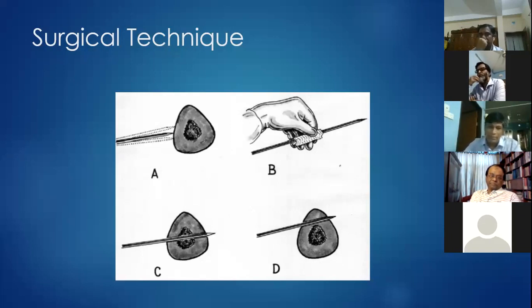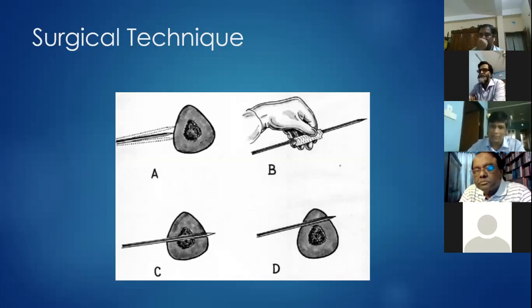When we reach the cortical bone, then start drilling with low speed drilling, and to avoid bending and to maintain a straight trajectory and to decrease the temperature or heat produced during drilling, we can use a wet sponge, which can be gripped at the entry point. We wetted the sponge with alcohol, or maybe chlorhexidine also can be used.